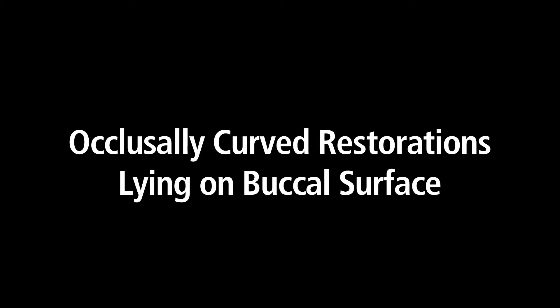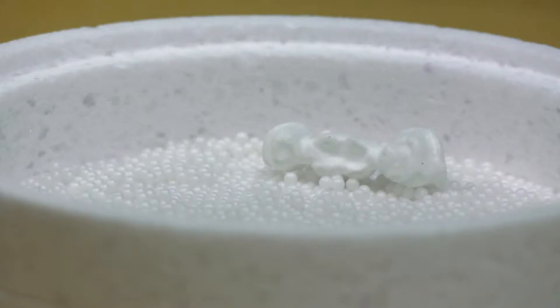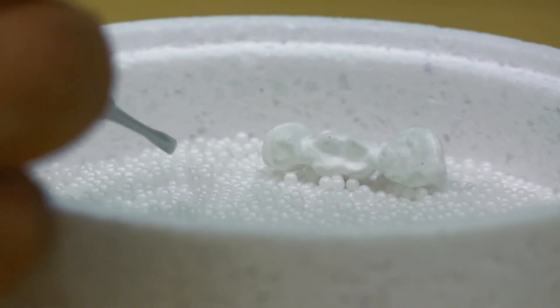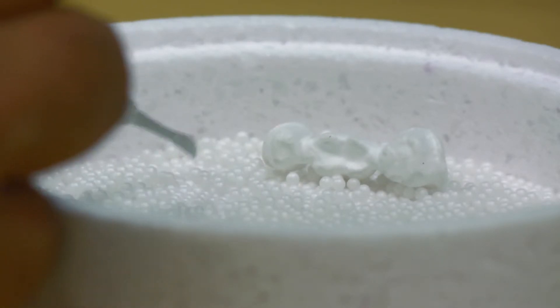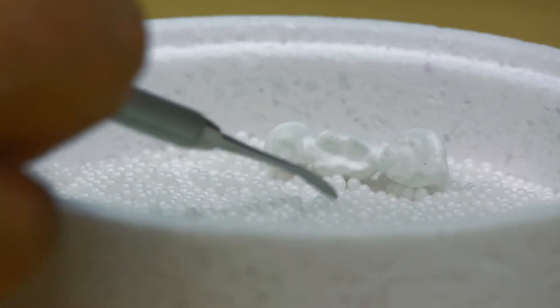Position crown and bridge restorations on the occlusal side of the restoration. Very occlusally curved bridges, or on the Spee's curve, are always to be placed on the buccal or labial side of the restoration so that the center bend of the restoration is lying on the sintering beads.